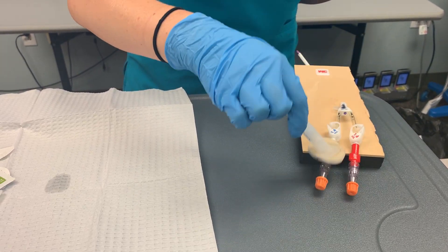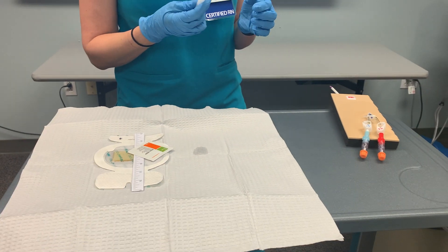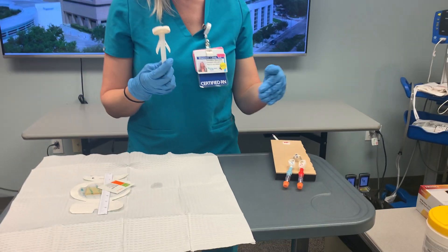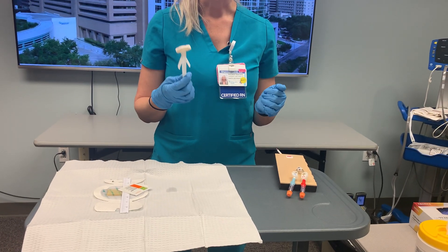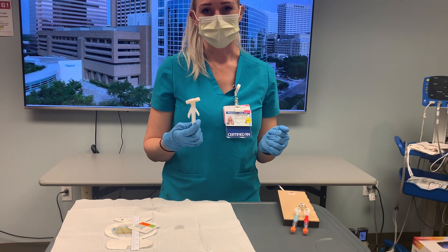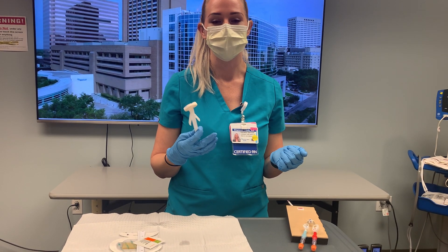We'll scrub up the lumens as well. We need to let this dry for at least 30 seconds to a minute per the manufacturer. In my past experience, I would say you need to give it a minute to a minute and 30 seconds — we want all that shininess to go away. If we place our dressing on top of the chlorhexidine while it's still wet, there's a very high chance the patient will have a reaction and may think they're allergic to chlorhexidine, which will prevent them from having the best possible dressing placed on their line in the future.